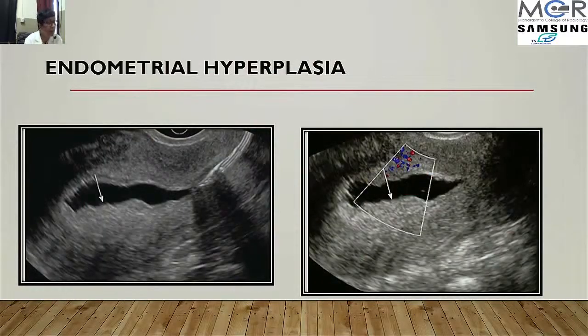Here again, that patient on tamoxifen, we got to see endometrial hyperplasia. Tamoxifen is known to cause an anti-estrogenic effect on breast, but not on the uterus. We can have thickened endometrial lining. On doing biopsy, this turned out to be a non-malignant hyperplasia.